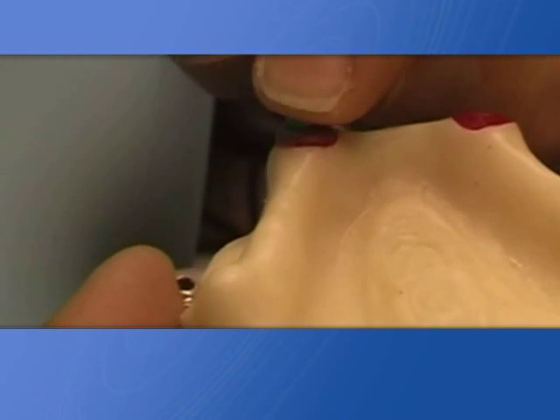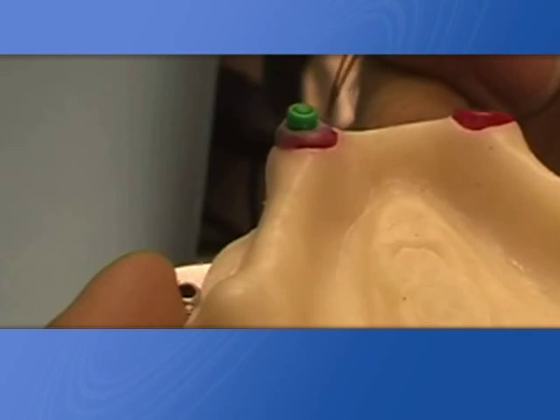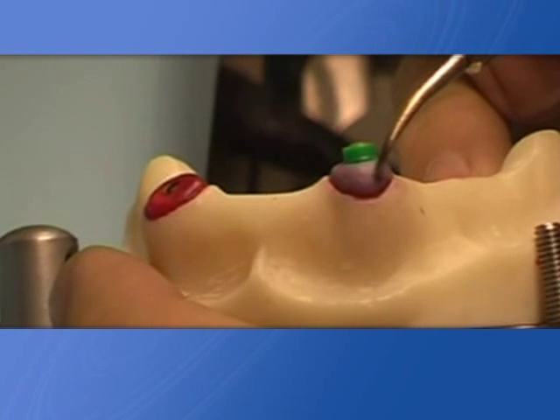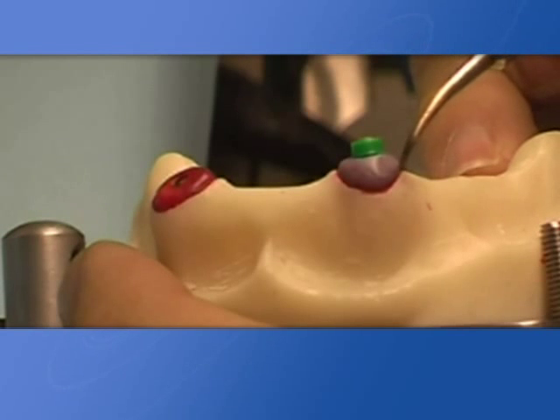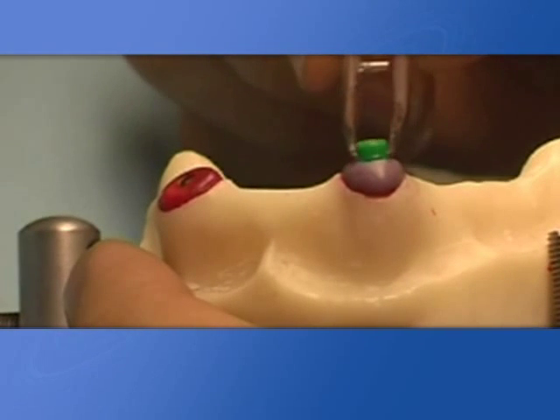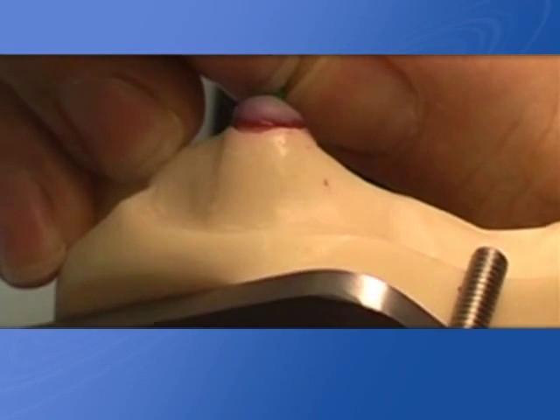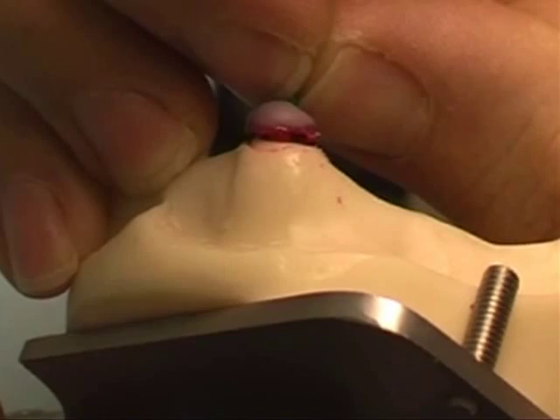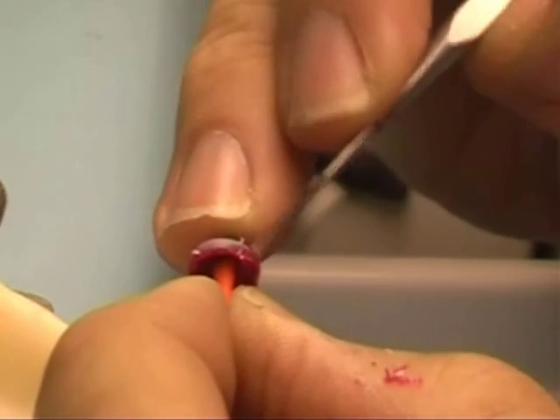The positioning ring set over the sphere will protect it from stains during waxing up. Remove the cover. Check and refine the flank border, sprue it and cast.